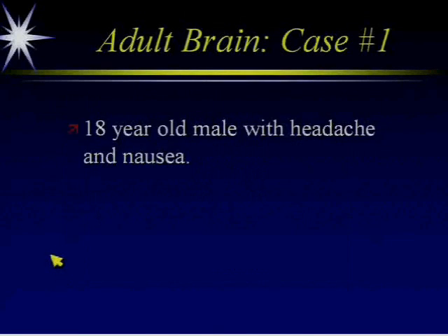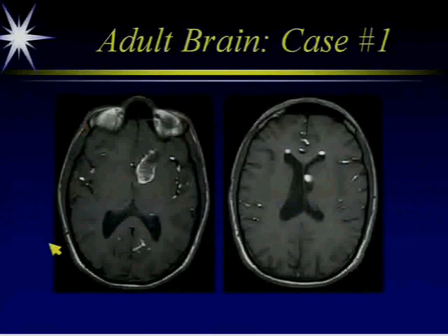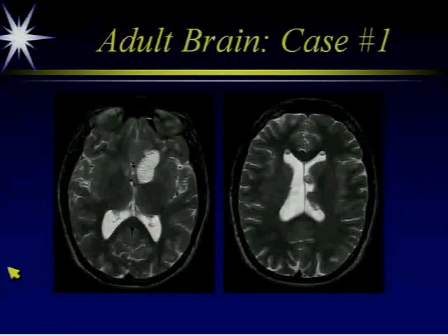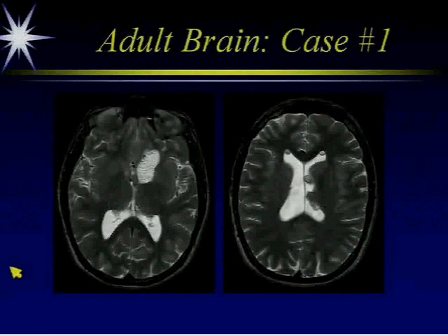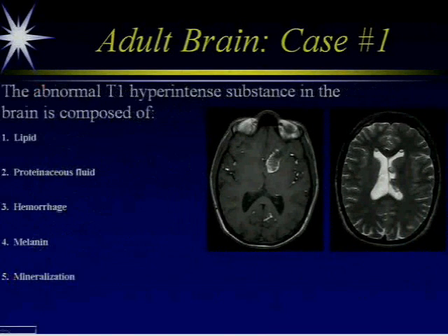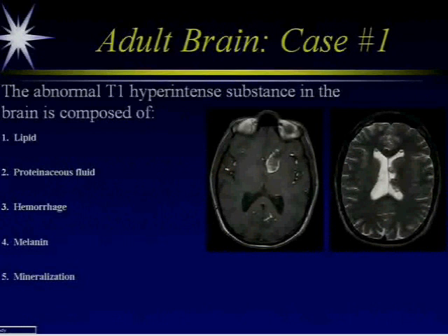A patient presents with headache and nausea. Here are your first couple of images and some additional images. The first question is: what is the abnormal T1 hyperintense substance in the brain? Is it one: lipid, two: proteinaceous fluid, three: hemorrhage, four: melanin, or five: mineralization?